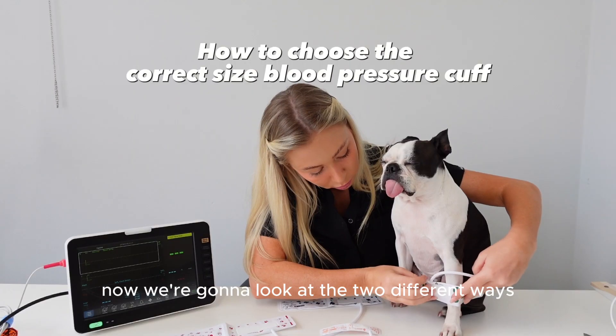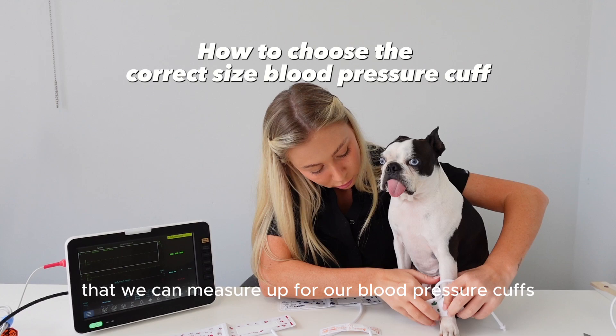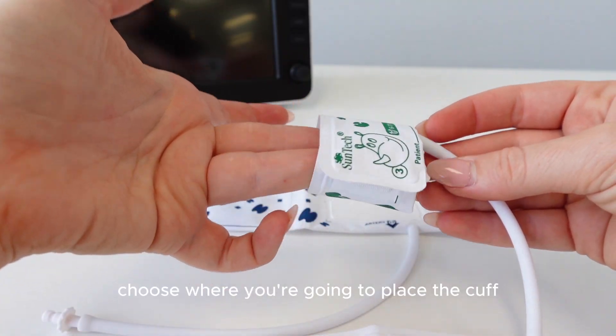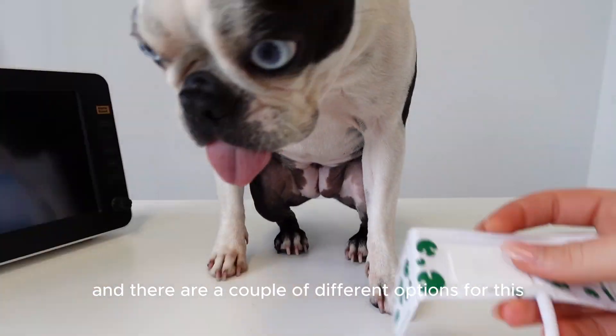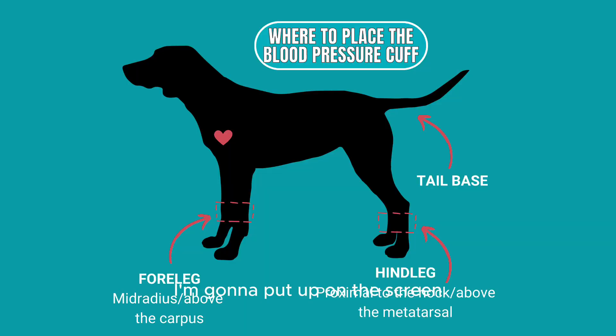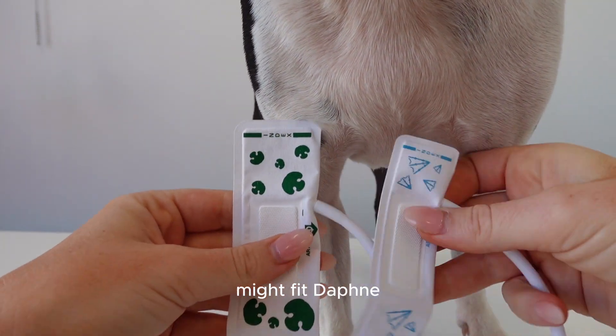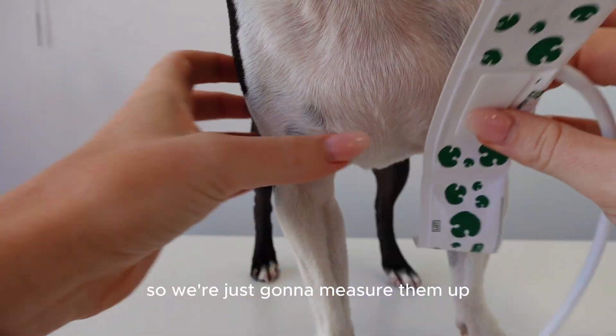Now we're going to look at the two different ways to measure up for blood pressure cuffs. First, choose where you're going to place the cuff — there are a couple of different options. My favourite is probably the tail base, because the width of the tail is always fairly uniform, whereas with the leg some dogs are bony and some are a little overweight. The tail is usually pretty reliable. These are the two cuffs I'm guessing might fit Daphne, so we're going to measure them up and see which fits better.